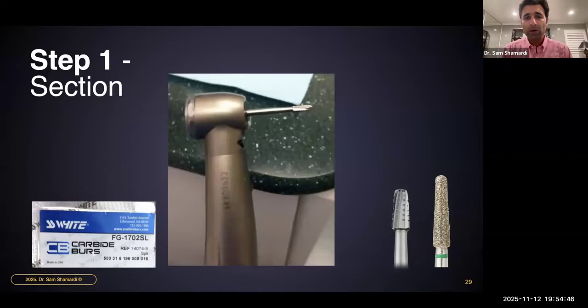As mentioned, when we want to section our teeth, we're going to utilize an electric handpiece to have the highest amount of watts available to us, the most amount of torque. And as far as burrs are concerned, anytime we're having to cut through very aggressive metal or crown structure, we're going to utilize an aggressive diamond to cut through that crown structure. Of course, if you have a crown remover that you can get in and underneath, great. But if you don't, you will use an aggressive diamond.